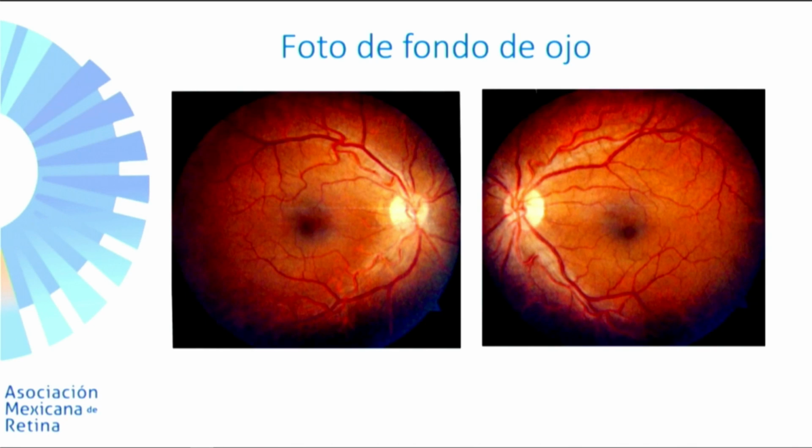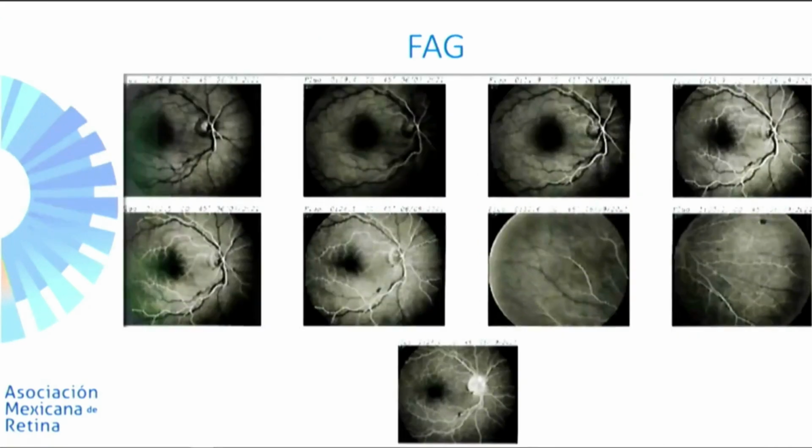This is the fundus. When checking the fundus of this patient, well, there is nothing that calls our attention that much. Maybe the vascular tortuosity, these arteriovenous crossings. And with this image, after seeing her and taking a look at the photo, I couldn't get much information.